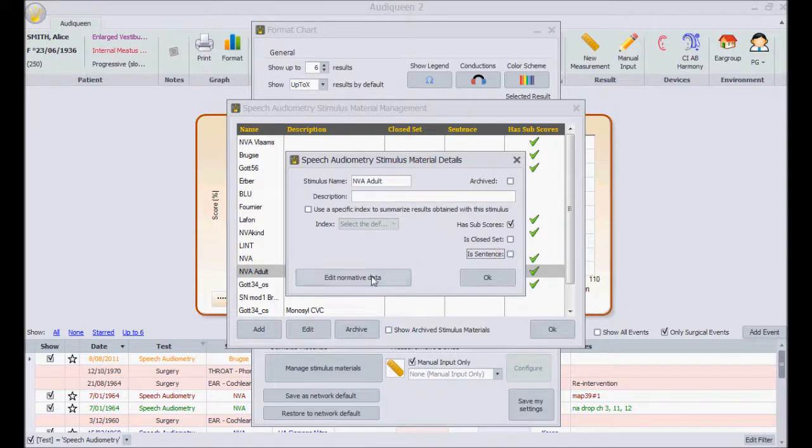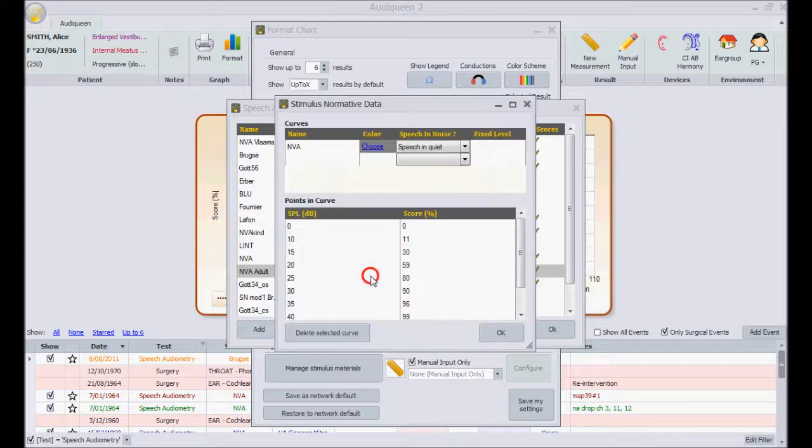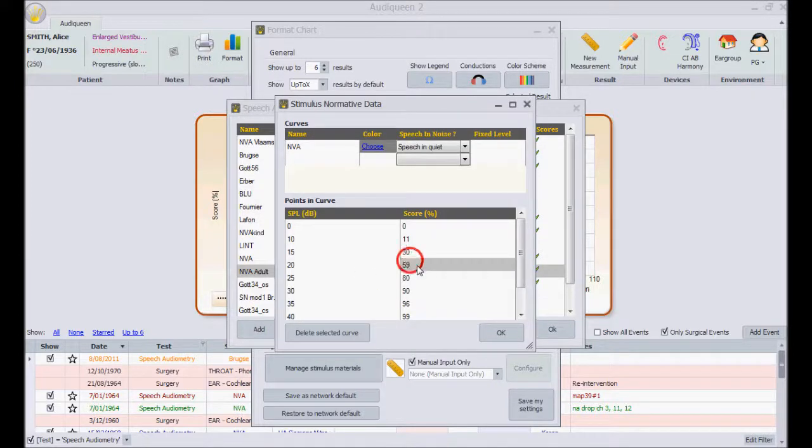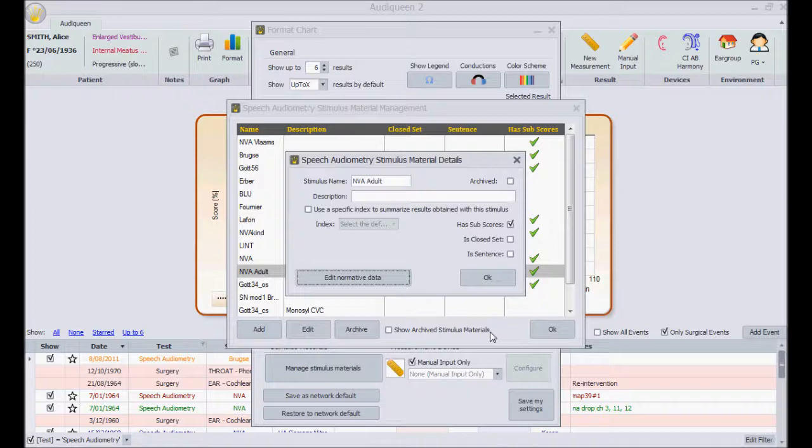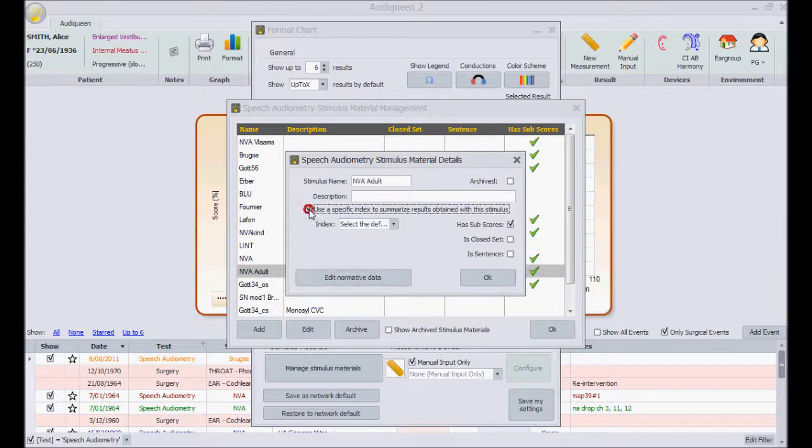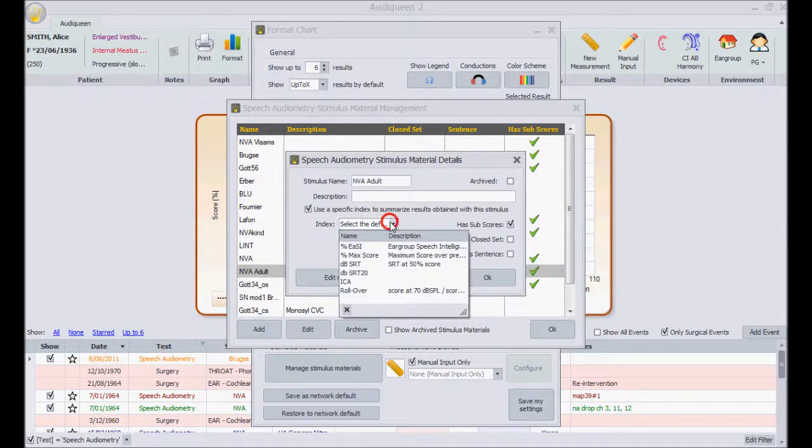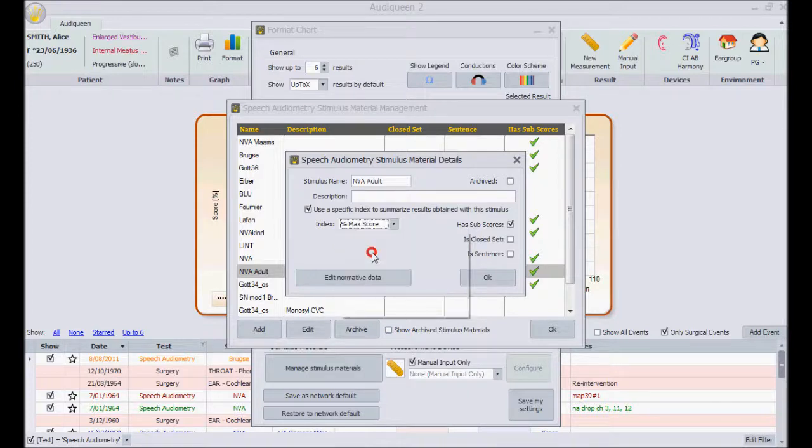Add a normal reference curve, or set an index that should summarize this test by default.